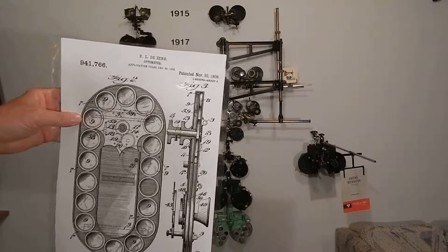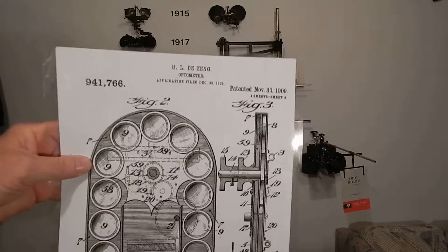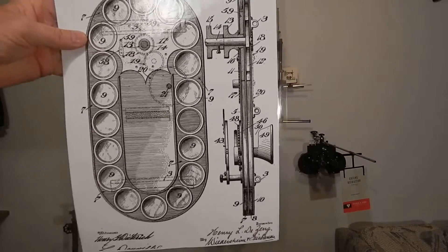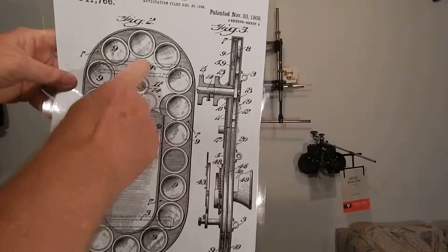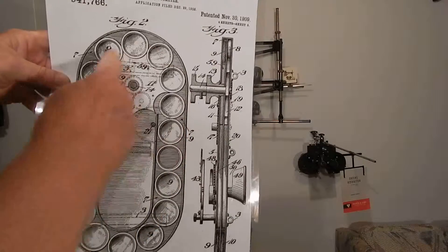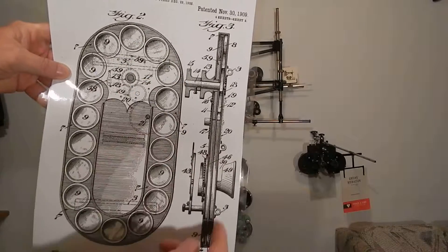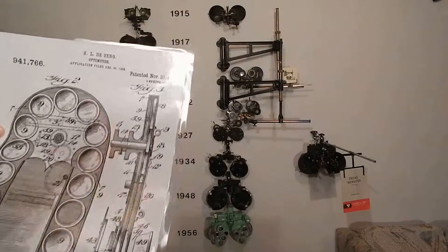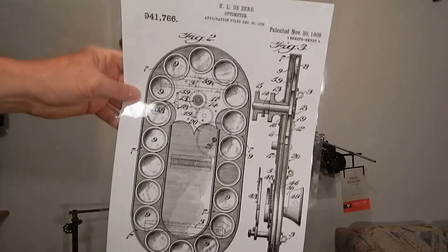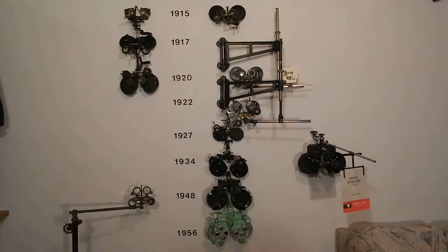He got the patent in 1909, and holding it up here — it's quite an elaborate device. It's got a big star gear that turns a channel of lenses all in a big circle, with Maddox rods, Risley prisms, and cylinder on it. If you look at this patent it looks like the first phoropter, but nobody ever made it, and it really had nothing to do with what they actually made.